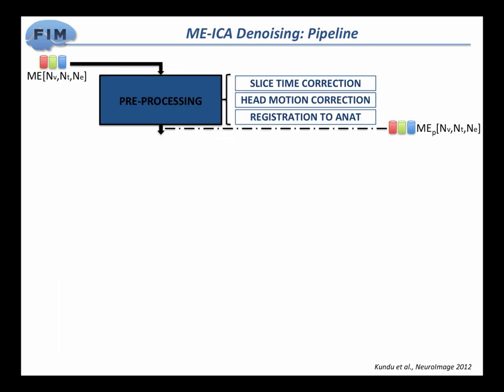So how does the algorithm work on the inside? Just for those of you who might be interested in using it. So the MEICA package, as it is provided, or the set of scripts that form MEICA, will do it from beginning to end. They can take the data out of the scanner, do all your pre-processing, and give you the denoised time series. That doesn't mean that that's the only way of using it, okay?